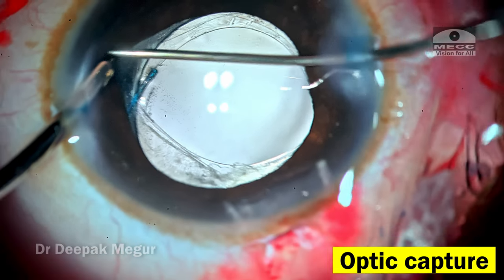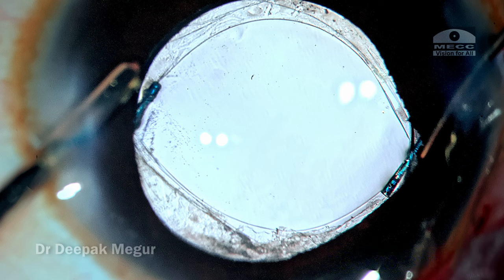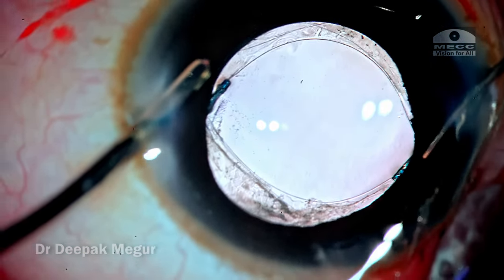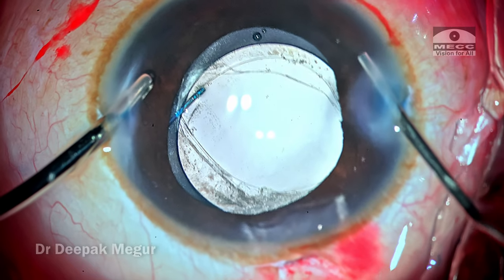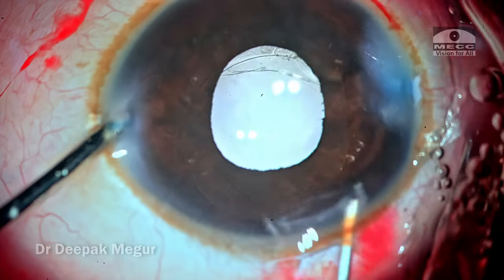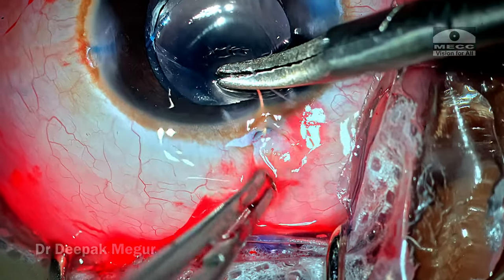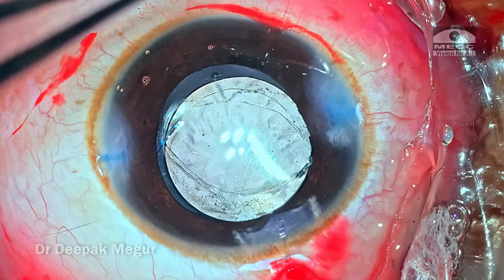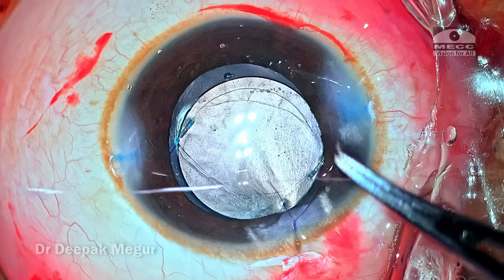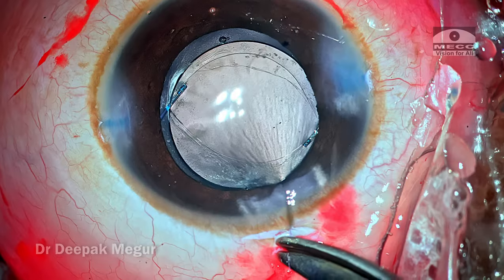The optic capture is confirmed by the ovalization of the rhexis. We can see both the haptic-optic junctions — the optic has slid behind the rhexis — and this ensures excellent long-term stability. Before coming out, I am injecting diluted intracameral pilocarpine to bring down the pupil a little bit. I use a 10-0 Vicryl suture to close the main incision, especially in children with low scleral rigidity in a post-vitrectomized eye, as hypotony can suck in fluid from the conjunctival flora and create infection risk.